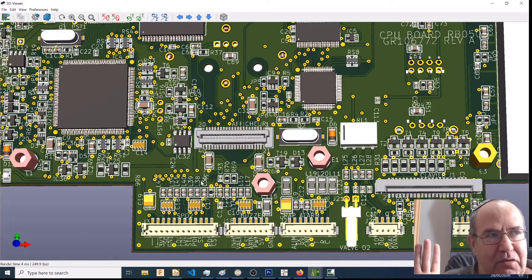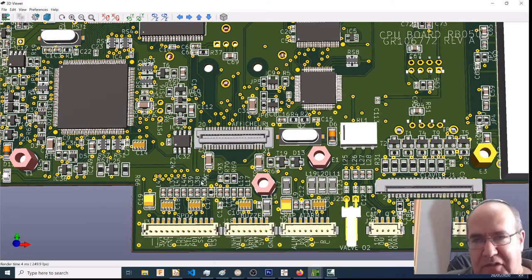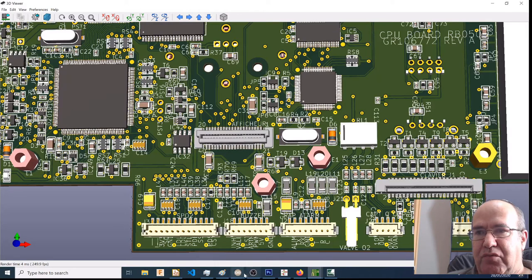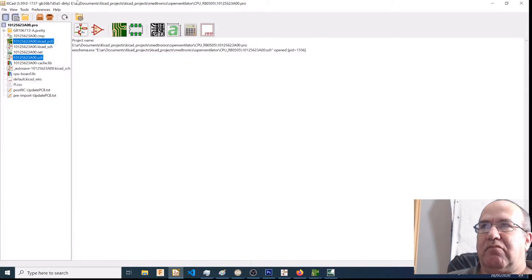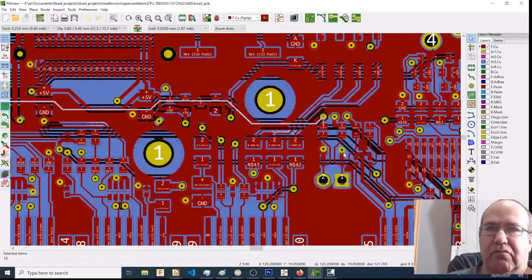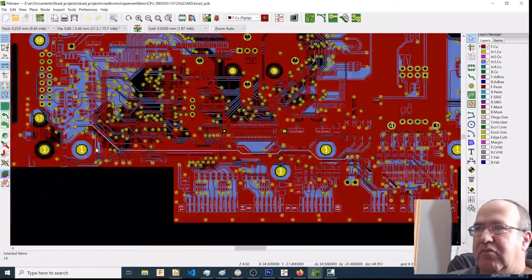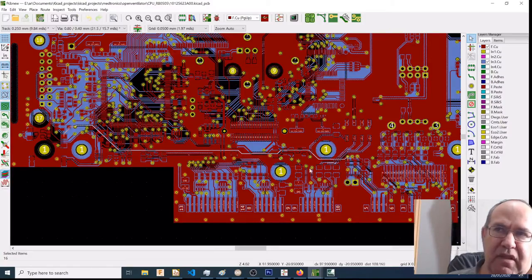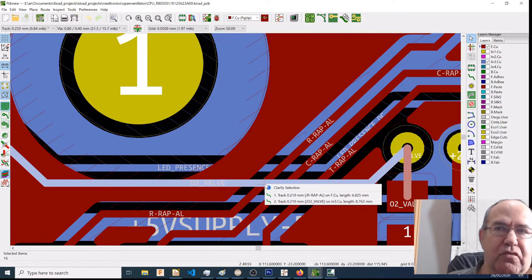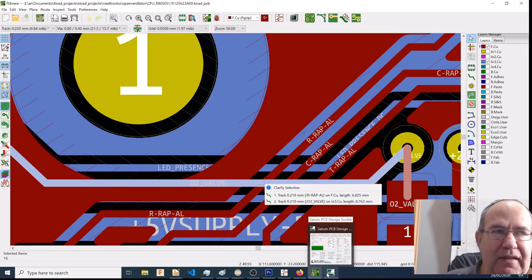I didn't design this board, and possibly the current for the original part didn't require more than an 8 mil trace. I'm going to move back to the 2D view. One can see the trace going through, and this trace is 0.210 millimeters, which is about 8 mils metric.